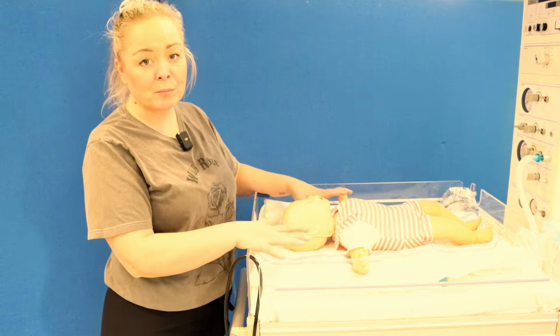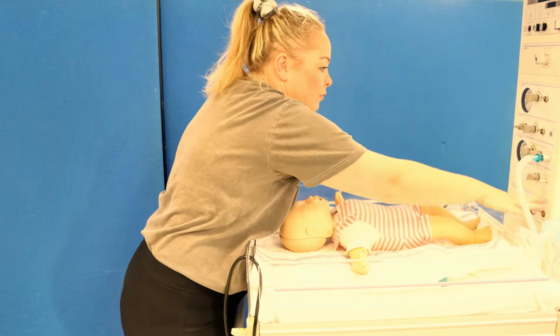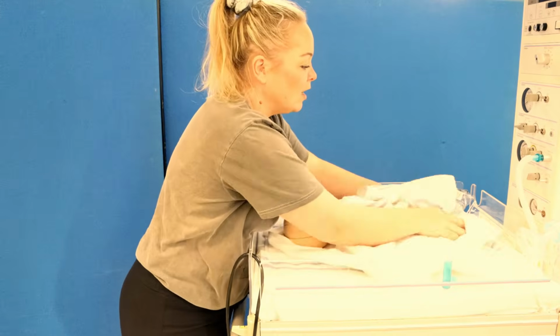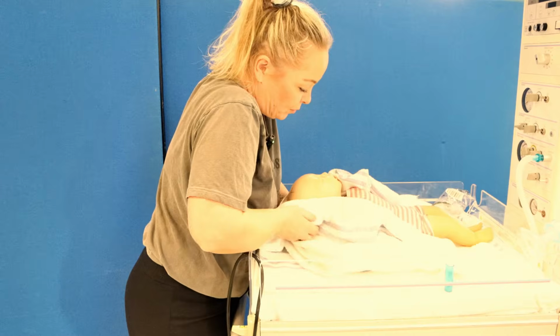So baby has just been born and placed in the resuscitator. I'm going to turn it on, turn the heater on and turn all of my oxygen and suction on. It's ready. So baby's just been born in poor condition, so I'm drying and stimulating. I'm also going to pull my buzzer and get some more help.